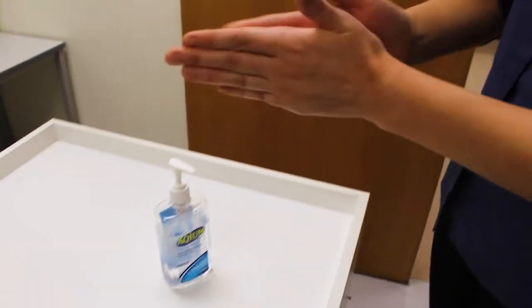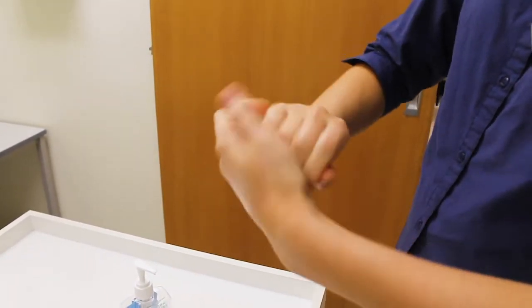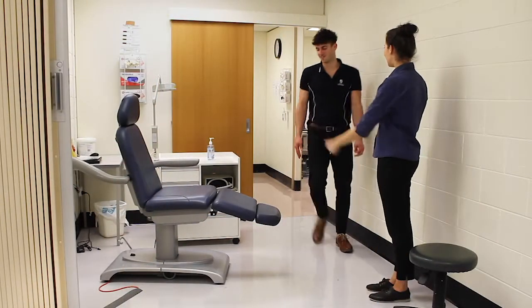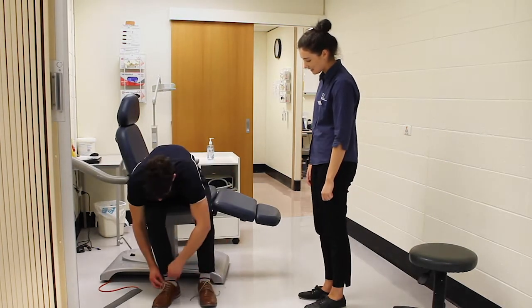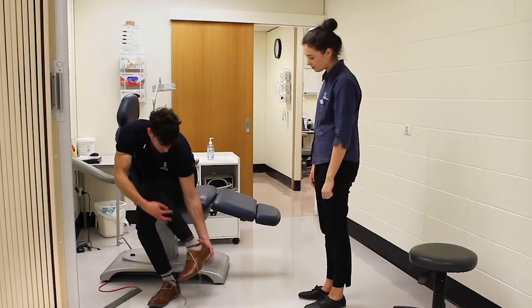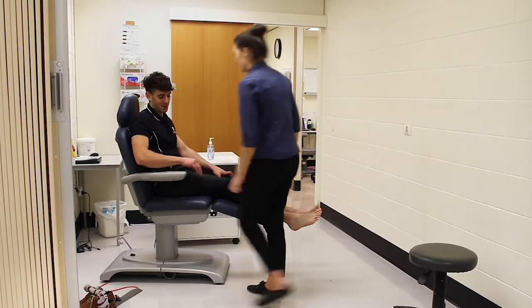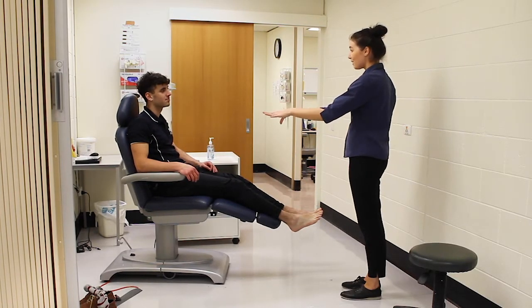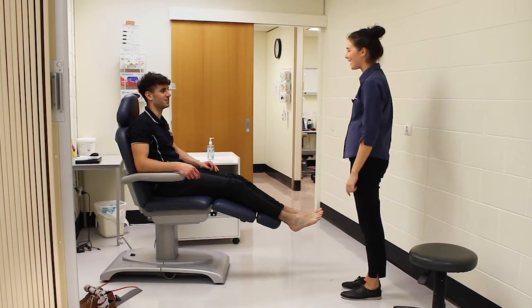Ensure appropriate hand hygiene and infection control practices have been followed before seeing a new client. An Ankle Brachial Index or ABI test compares the blood flow in the arms, close to the heart, to the feet, far from the heart. If possible, recline the person. Ask the person for verbal consent and explain the process will involve placing blood pressure cuffs onto the person and listening to their blood flow. This test will help to indicate a more accurate understanding of the quality of blood flow to the person's feet.